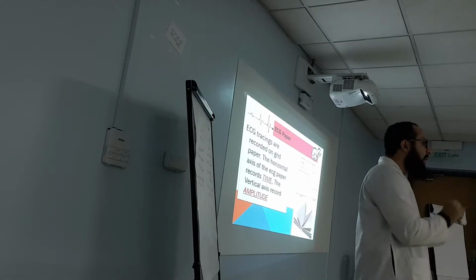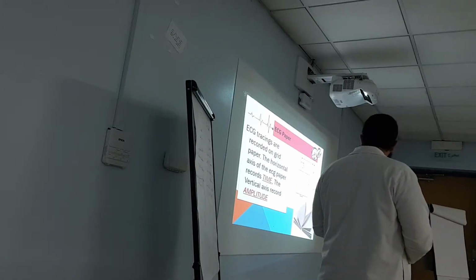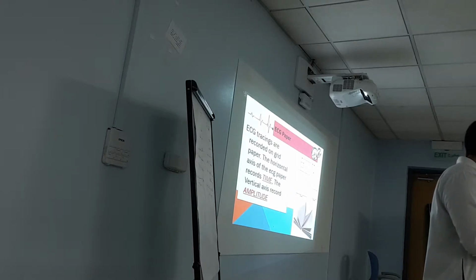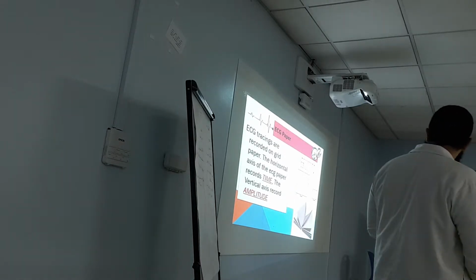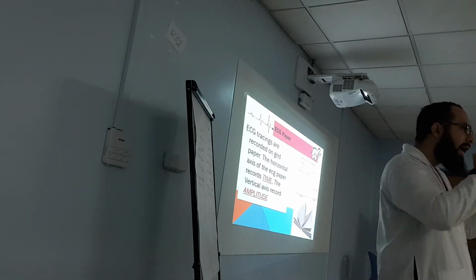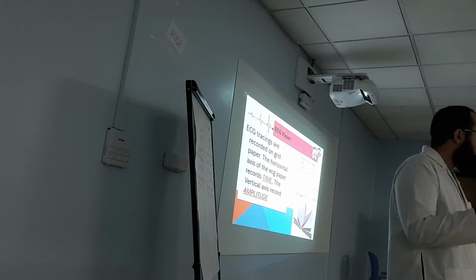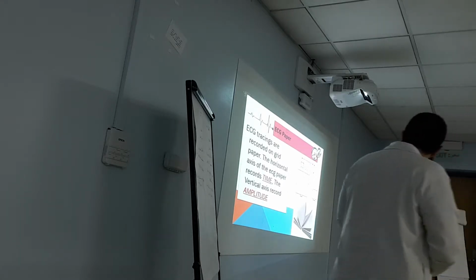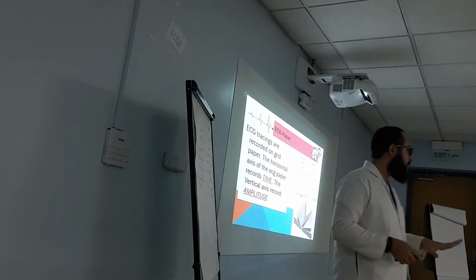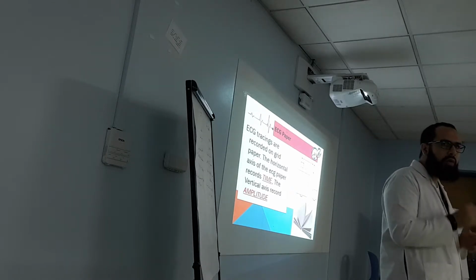So we will learn individual waves, and this is a good start that you know already from the previous lecture. But I'm talking about the paper now. If you have abnormality or normal, how will you differentiate from the paper? You count the paper itself. It's like a ruler. Before, you didn't have the printout, so you brought a ruler and measured the waves. But now the paper has the ruler, so it's a matter of counting how many squares, large or small.